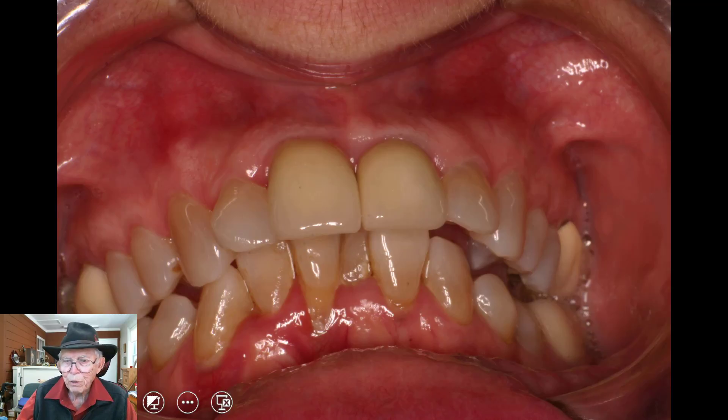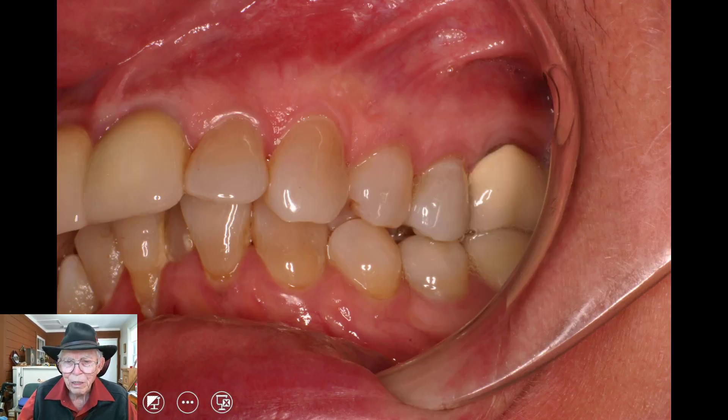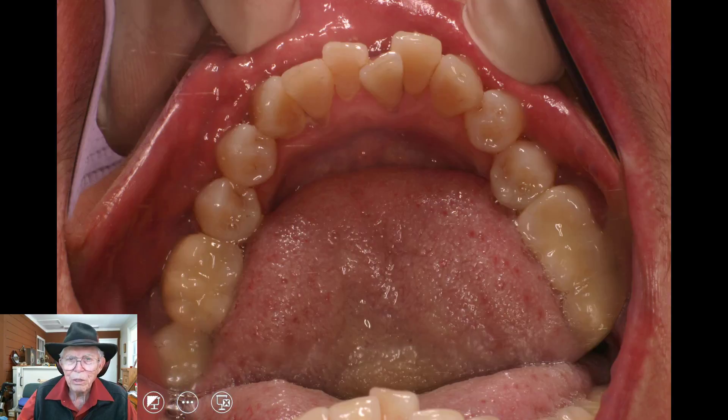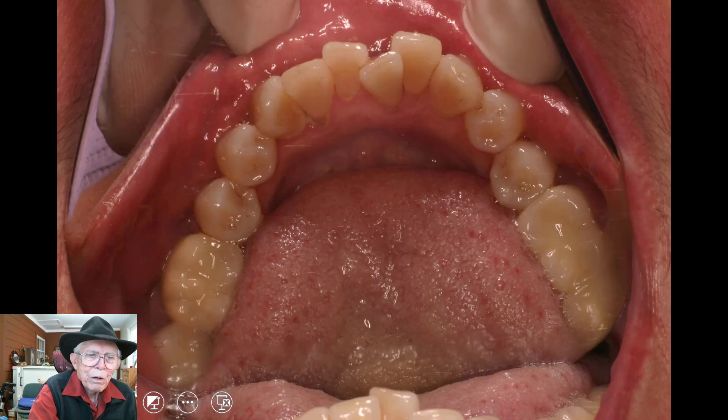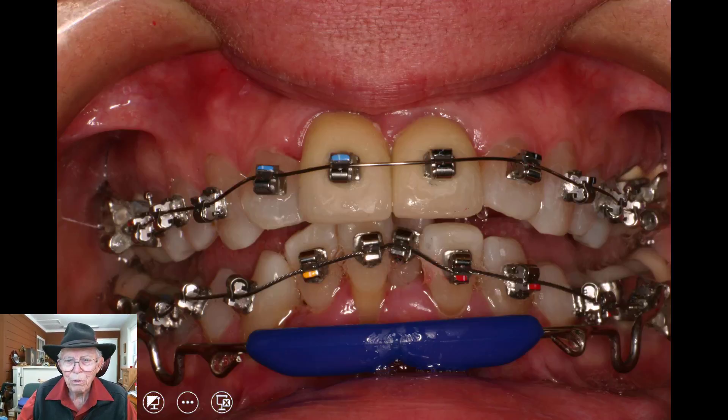She could bring her teeth up to this point right here, but the lower anteriors were poking — this tooth right here was poking into the roof of the mouth up there. Now I'll show you what we put on her. This is more or less what we got after we got through the case. That's the lower arch — it's crowded, and it has a tremendous curve in there. These teeth are up in the roof of the mouth, and these are down where they occlude. It's 10-07.